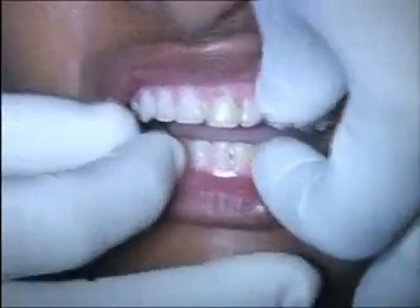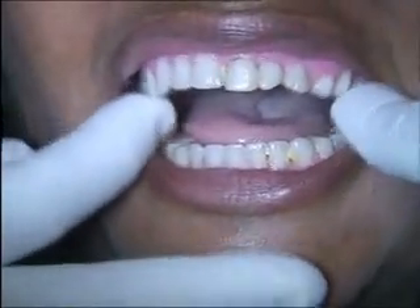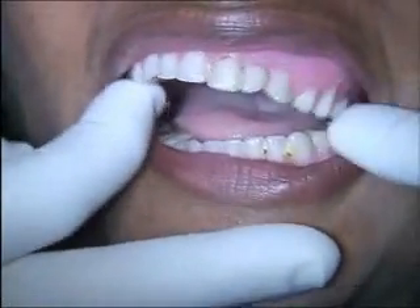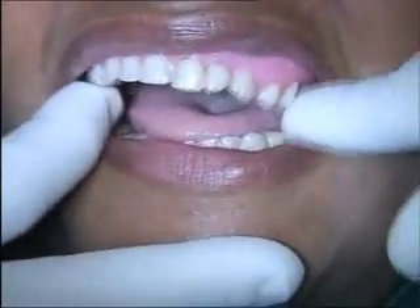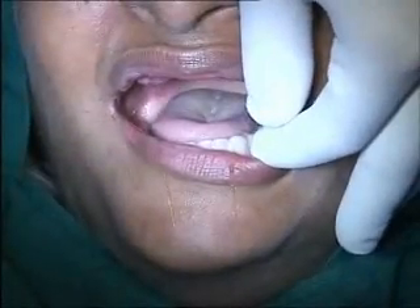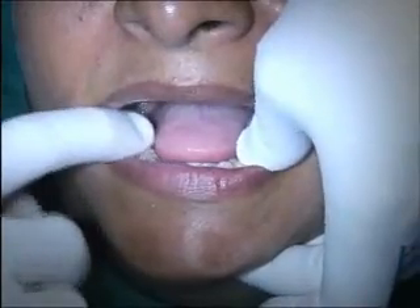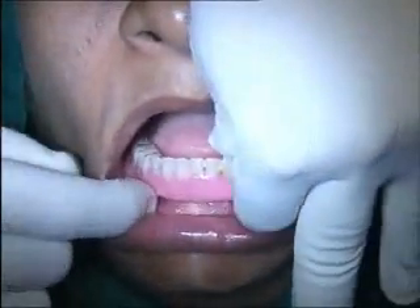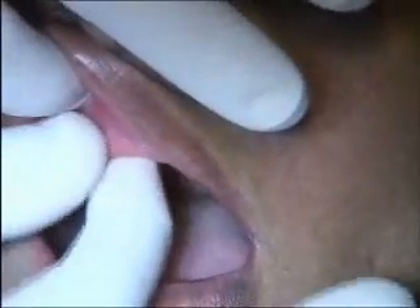Look at the moment of removal — the denture has zero retention at all. It's not a wonder this patient won't have fixed prosthesis; they must be very frustrated with the situation. The denture is floating with zero retention and stability. On palpation, the ridge is very flabby — though that doesn't mean there's a fantastic amount of bone available.